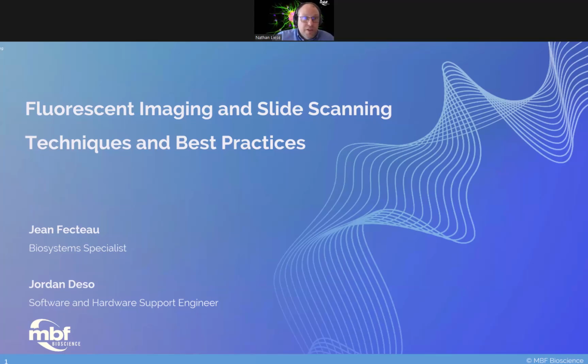Today, we have Jean Fecteau, a Biosystems specialist. He's a senior member of our on-site training and technical services team. He's been with us for almost 7 years. I'm sure some of you have called in and talked with him over the years. And we also have Jordan Deso. He's a software and hardware support engineer. He's a newer member of our team with a software background, specializing in our hardware solutions. He's been with us for about 2.5 years.